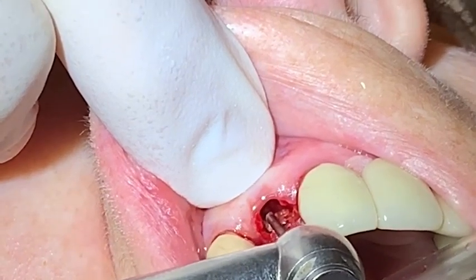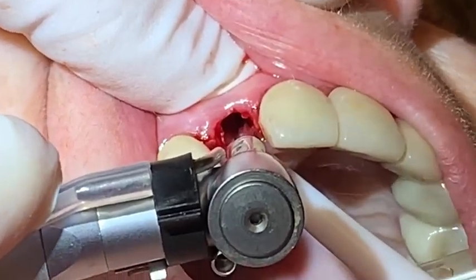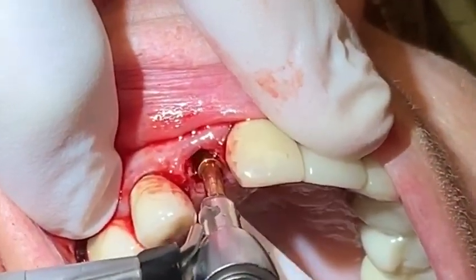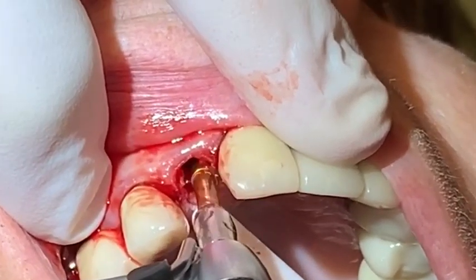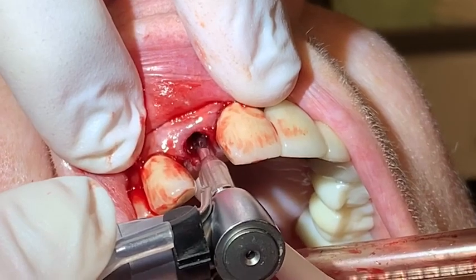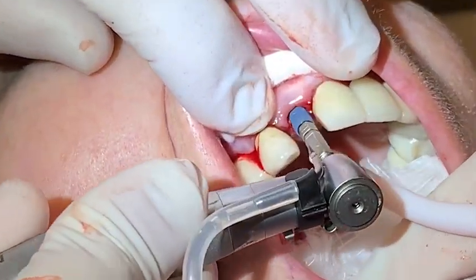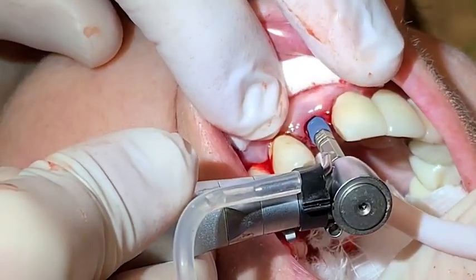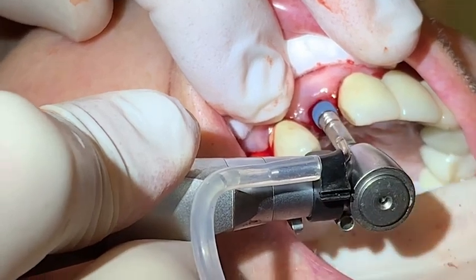The pilot hole was made with a long surgical 701 XXL high-speed burr. Then the manufacturer's drilling protocol was followed. Because of labial concavities in the maxillary, it is always crucial to try and place the implant in a more palatal aspect.